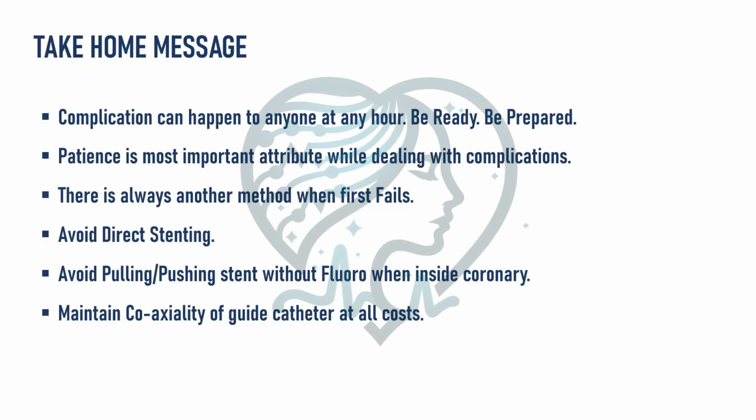So the take-home message is: complications can happen to anyone at any hour. Be ready, be prepared. Patience is the most important attribute while dealing with complications. There is always another method when the first fails. Avoid direct stenting whenever possible. Avoid pulling and pushing the stent without fluoro when inside the coronary. Try to maintain coaxiality of the guide catheter at all costs.